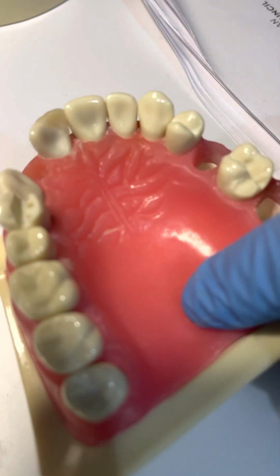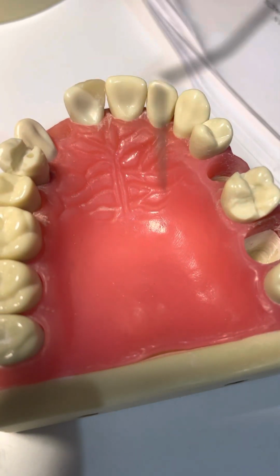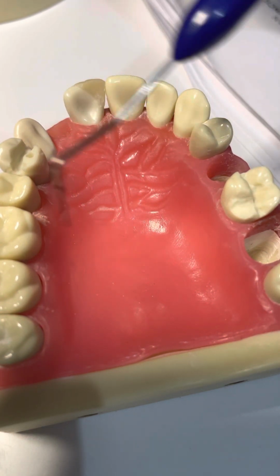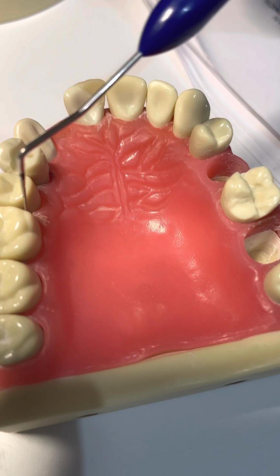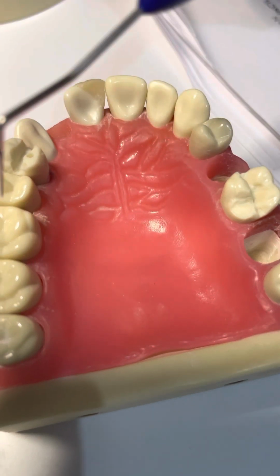With the upper molar, let's just talk about the anatomy of the upper molar. Upper molar anatomy is a bit weird. I find it's the most weird, complicated one, especially the plastic tooth, when they try to replicate the cusp of Carabelli also. Forget about cusp of Carabelli. Look into the 7. There is no cusp of Carabelli.